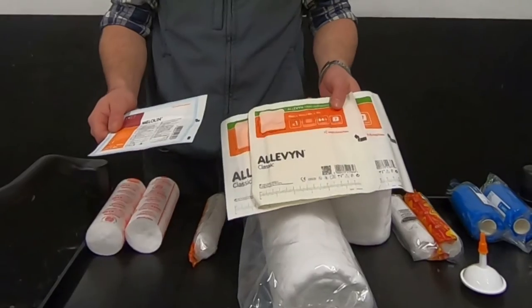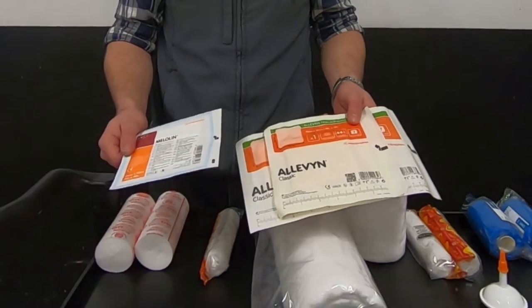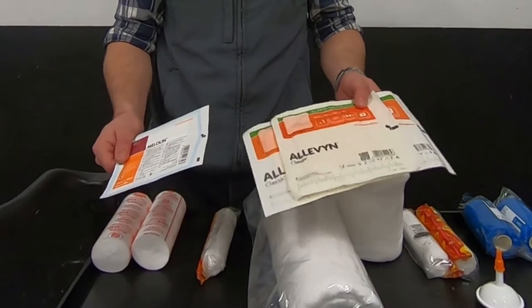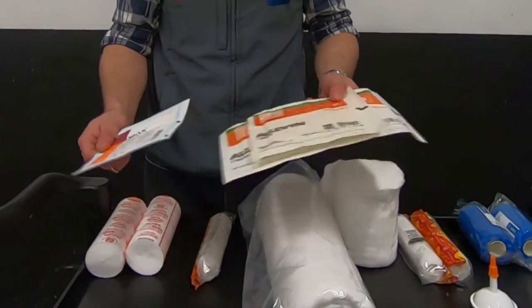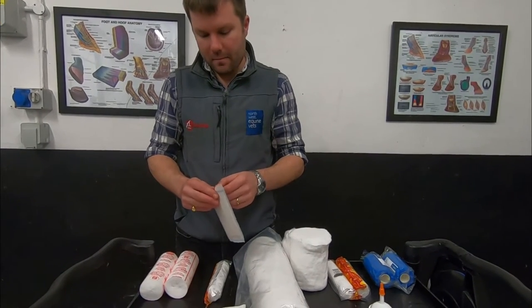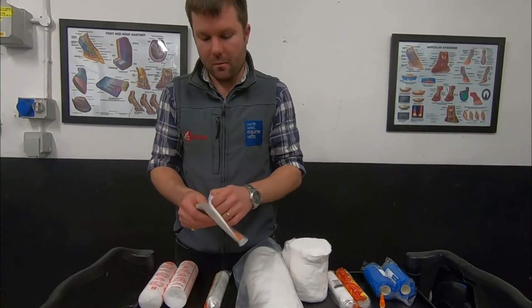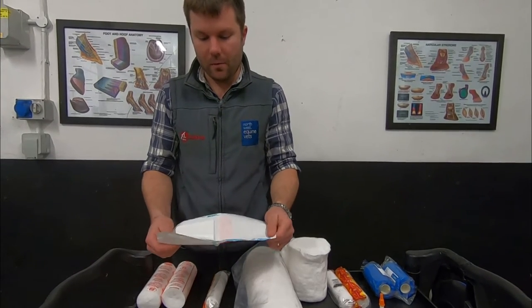Alevin is designed to absorb more fluid than Melalin. I tend to carry both, but find myself using Melalin a lot more than Alevin, partly because it's a lot cheaper. Apply your dressing by opening the packet and working out which side you wish to put on the skin.